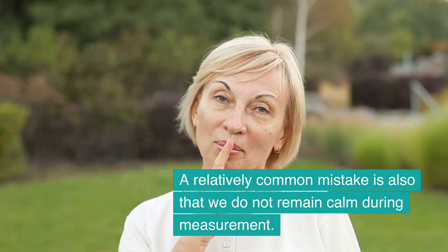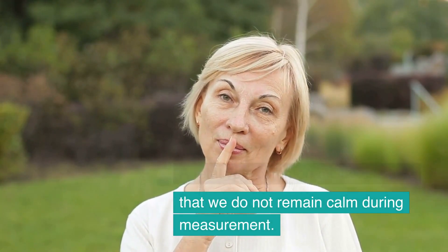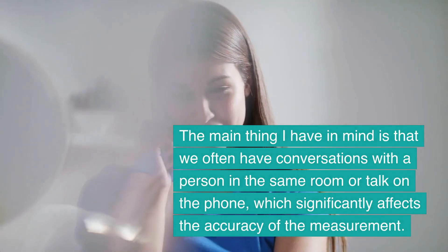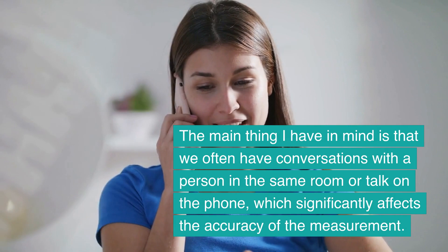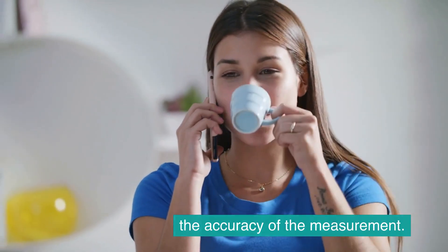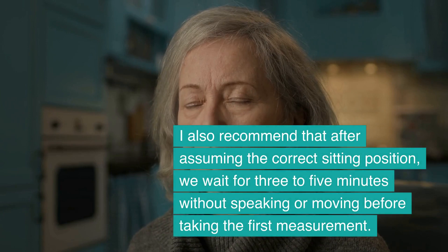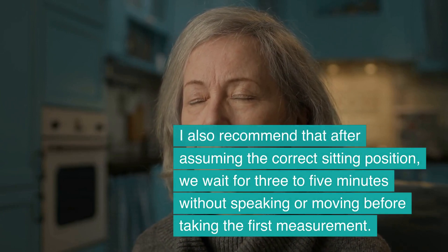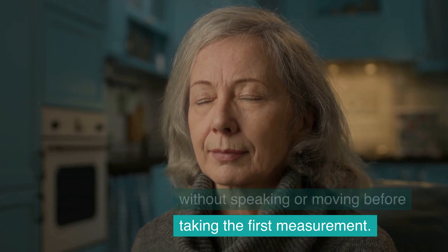A relatively common mistake is also that we do not remain calm during measurement. We often have conversations with a person in the same room or talk on the phone, which significantly affects the accuracy of the measurement. I recommend that after assuming the correct sitting position, we wait for 3 to 5 minutes without speaking or moving before taking the first measurement.